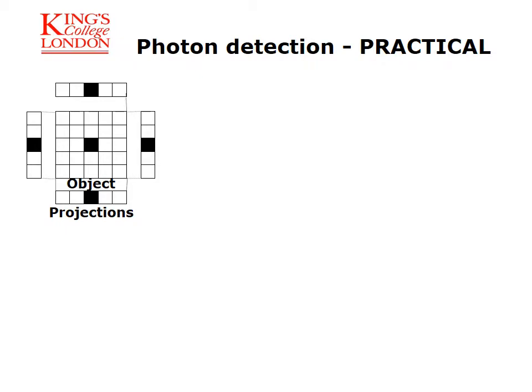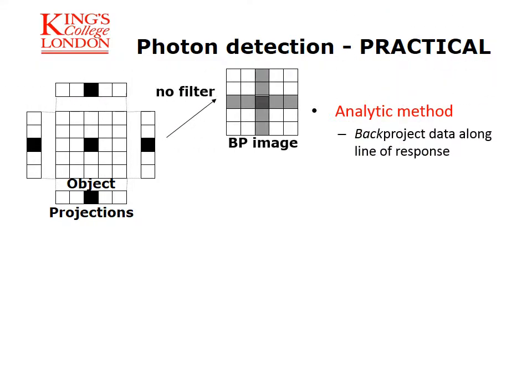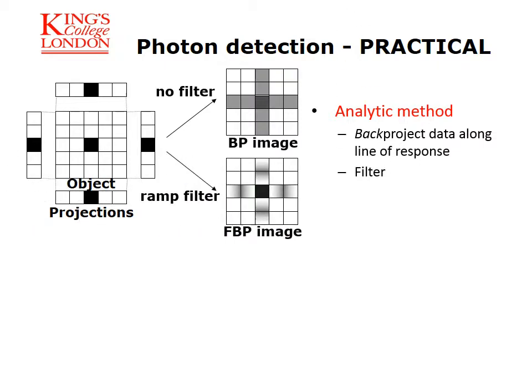The first one is quite simple in principle. It consists in projecting back on the image the projected data. This recreates the original image plus stripe artifacts that are eliminated with some filtering. In fact, this technique is called filtered back projection.